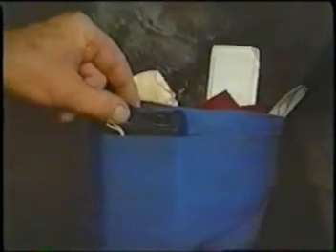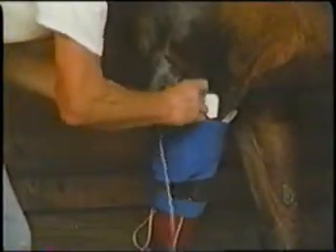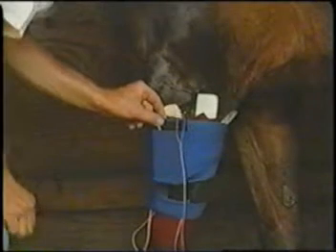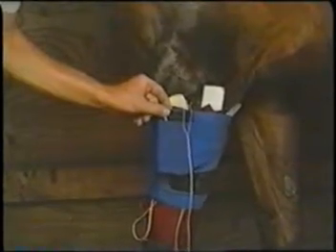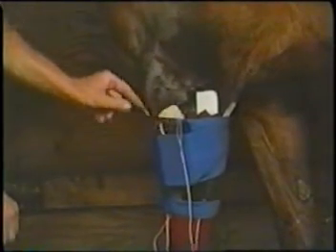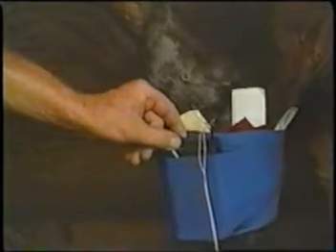Now you see the stimulator is in place and I am switching it on, and now you'll see the muscles begin to contract in a moment. There we go. Now if you remember the diagrams I showed you, every time the muscle contracts, it not only moves the leg to some slight degree, but most important of all, and that's what we are looking for, it stimulates the circulation. Therefore, as the muscles contract, the blood is pumped forcibly away from the injured area, and up towards the heart, and all the swelling is removed.